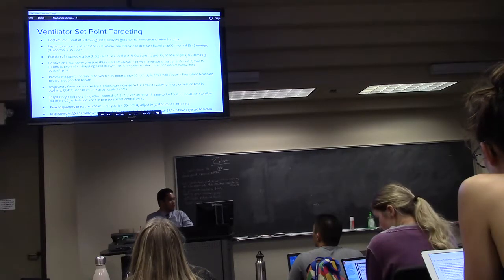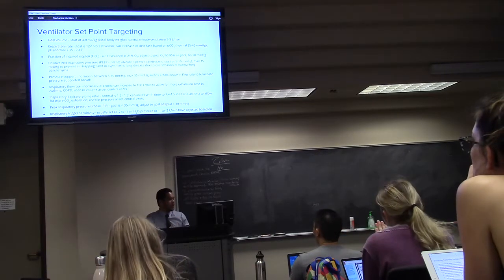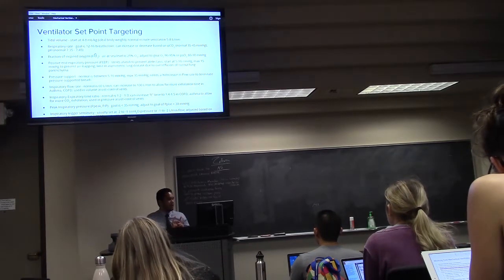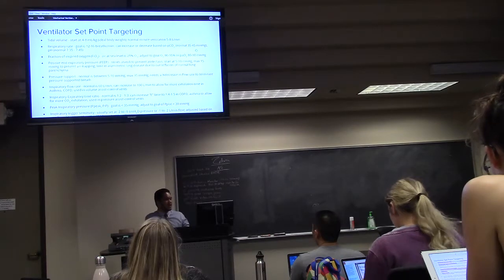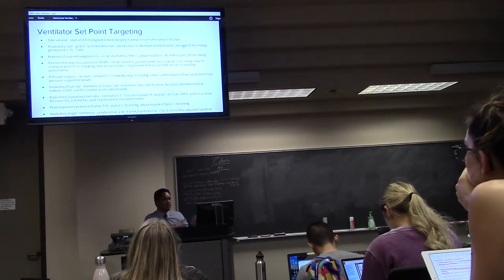say, if you're in a volume control setting or SIMV, then you have to set the tidal volume, and again, you use that chart, 4 to 8 mL per kilo, and then you set the respiratory rate. Sometimes I aim for 12 to 16. The reason that you would get that ABG 30 minutes after changing your setting is you need to look at that PCO2, make sure that you're not giving them too much respiratory rate. Say your PCO2 is starting to go down below 35, then you need to slow down that respiratory rate or decrease that tidal volume.